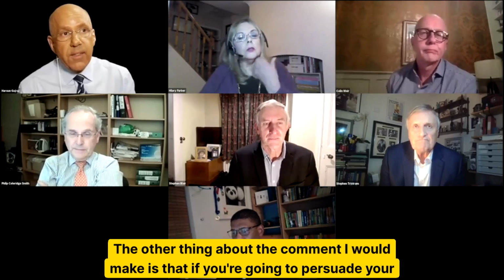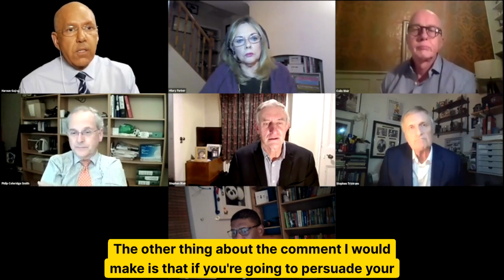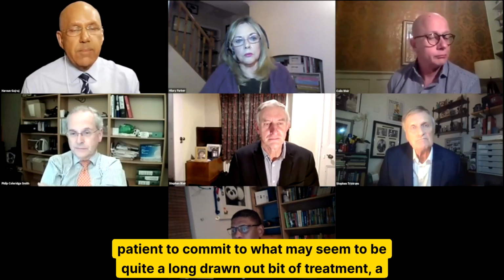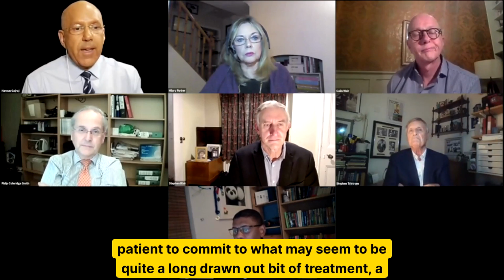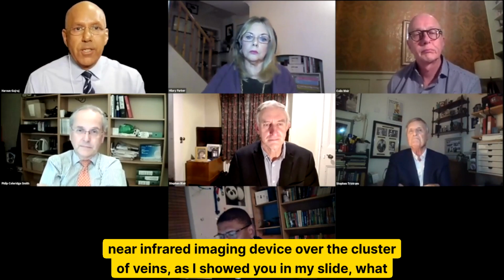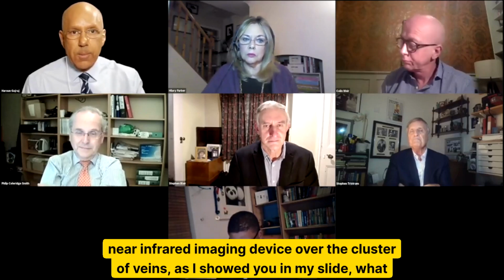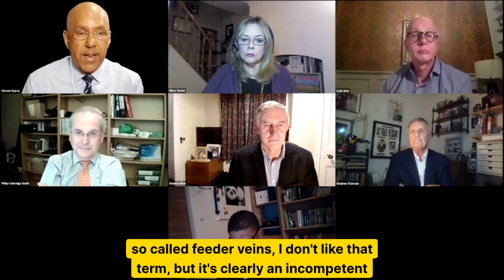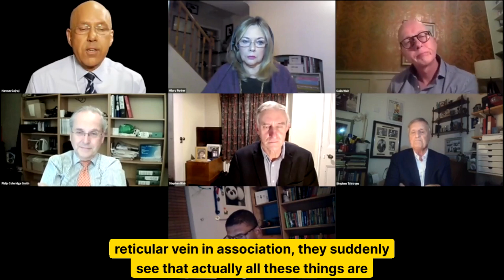The other comment I would make is that if you're going to persuade your patient to commit to what may seem to be quite a long, drawn-out bit of treatment, a near-infrared imaging device over the cluster of veins can help. As I showed you in my slide, what appeared to be a small little cluster of veins on the outer part of the leg, you demonstrate so-called feeder veins. I don't like that term, but it's clearly an incompetent reticular vein in association.